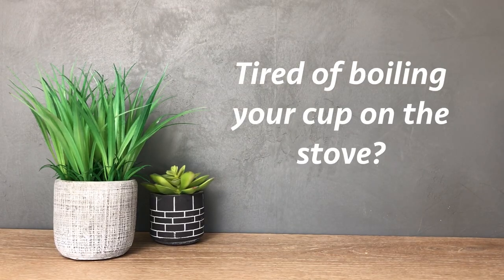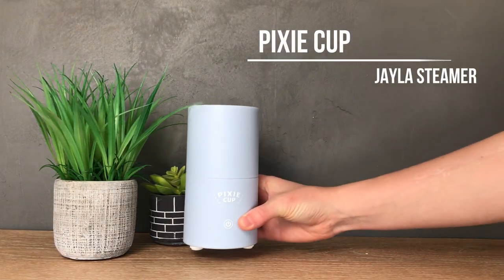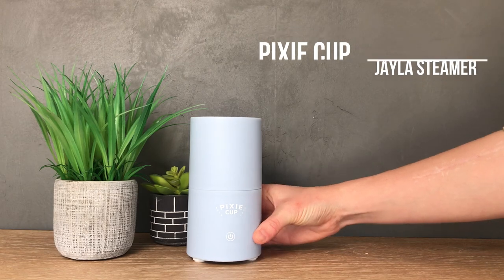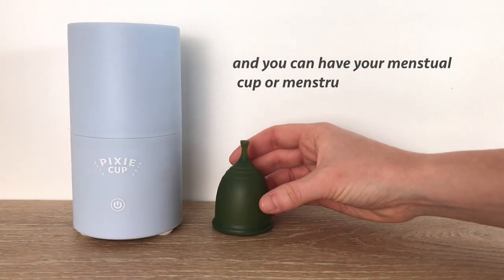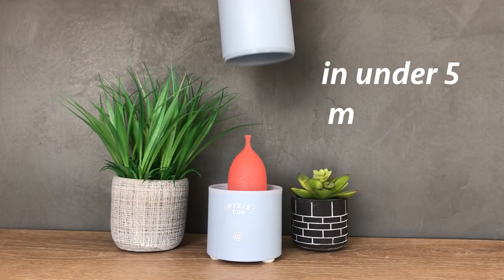Tired of boiling your cup on the stove? Introducing the Pixi Jayla steamer. It just takes three easy steps and you can have your menstrual cup or menstrual disc sterilized in under five minutes.